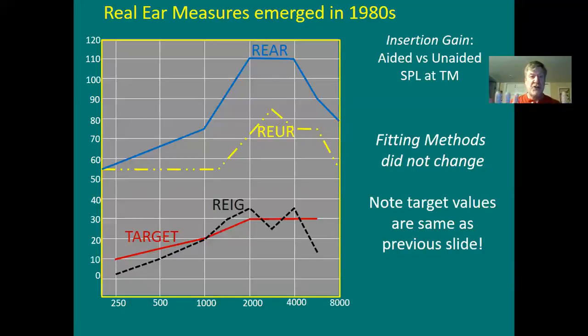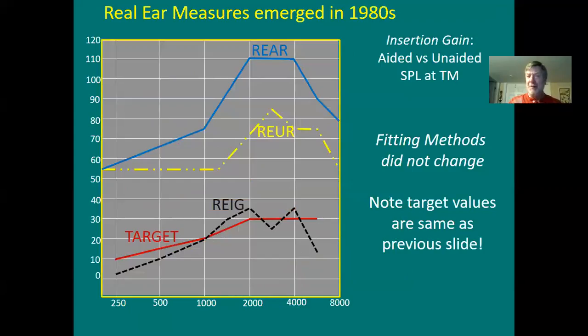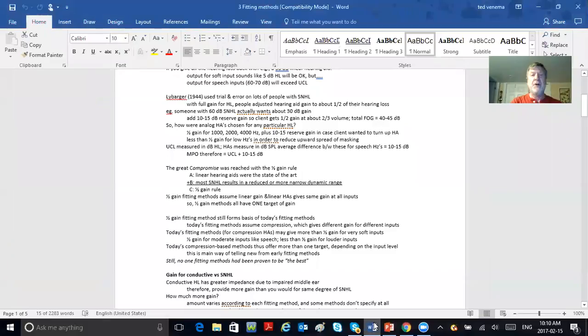Speech isn't on this thing. The audiogram isn't on this thing. Nothing's on. In a way, this is even worse than this as far as counseling goes. I mean, yesterday's real ear was quicker, but it was poor when it comes to counseling. It wasn't very good. Okay? Back to our typed notes here.